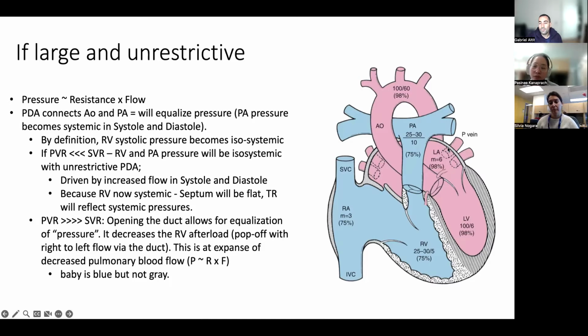And if you don't have any constriction of your pulmonary veins, so think about pulmonary venous stenosis at the ostium, or pulmonary venous occlusive disease, which means that you get a diffuse or partially affected pulmonary venous drainage system where they start constricting, or you have clots in your veins, like you can think about some of the thromboembolic disease of the lungs, where they can have clots in the arteries, but also in the veins.